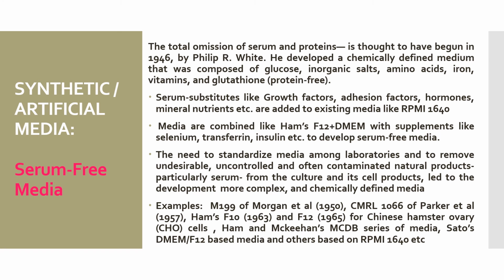Examples are the M199, the CMRL 1066, HAM's F10, and HAM's F12 for Chinese hamster ovarian cells. Then you have the MCDB series of media, Sato's DMEM, F12 based media, and others based on RPMI 1640.